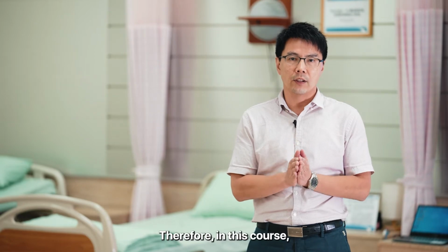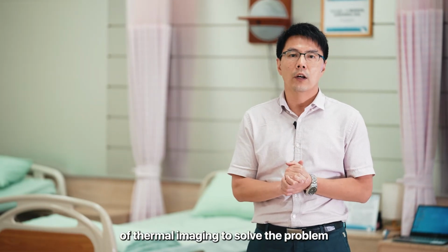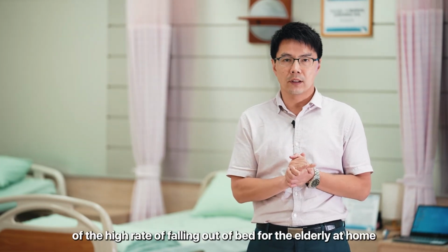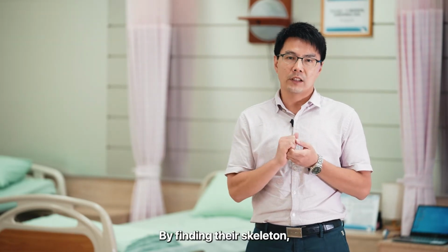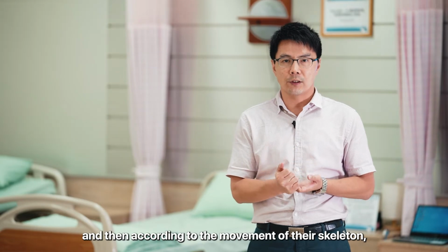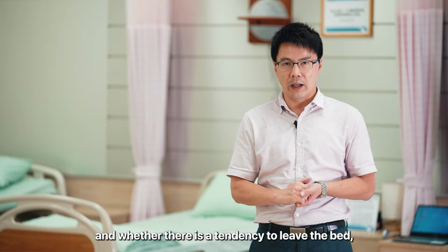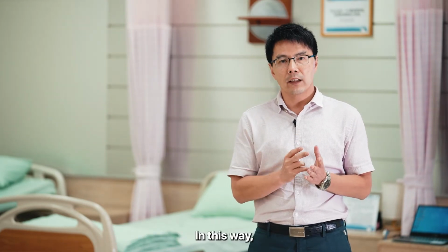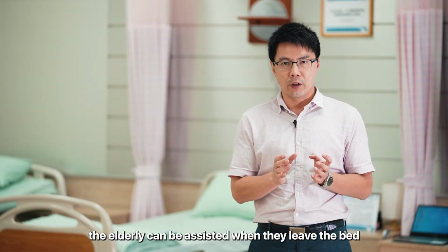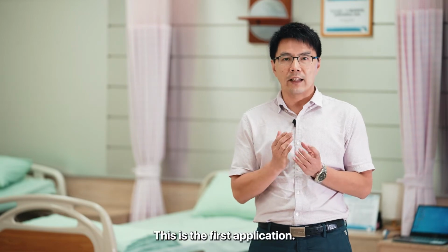Therefore, in this course, we will introduce 2 cases later. The first case is to use the lens of thermal imaging to solve the problem of the high rate of falling out of bed for the elderly at home or in institutions or hospitals. By finding their skeleton, and then according to the movement of their skeleton, to determine their activity state in bed, and whether there is a tendency to leave the bed, and then notify or inform the caregiver. In this way, the elderly can be assisted when they leave the bed and avoid the chance of them falling at the bedside. This is the first application.